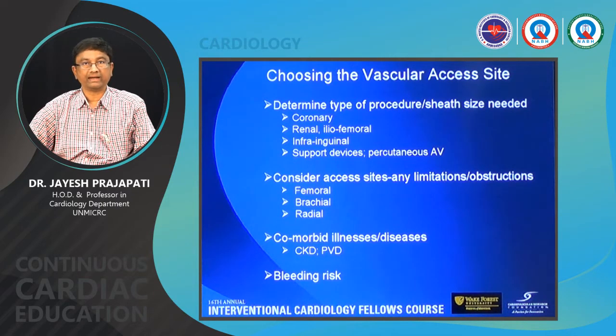And of course I have told you about the sheath size, we have to be very careful, and catheter limitation or balloon hardware limitation, that always we have to keep in mind. And of course the support, sometimes we need more support. So always we have to plan the access and the procedure. Suppose the patient has too much tortuosity, we require good guiding support. So then we have to think whether femoral, and that depends upon your experience and availability of hardware. Sometimes femoral is better in such cases, where good support is required, where we want to push and exchange more and more devices and we are not confident. In such situations sometimes femoral is better.